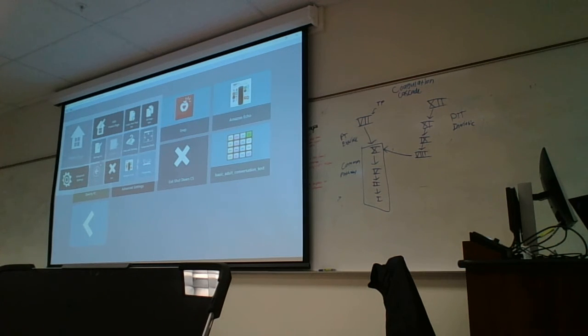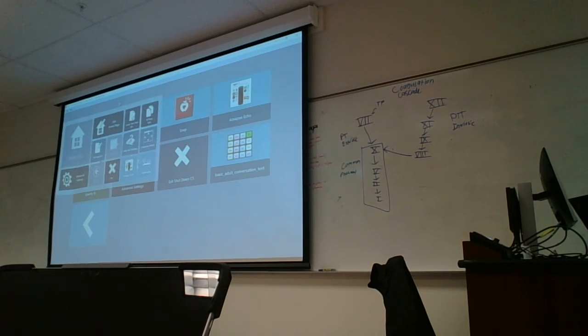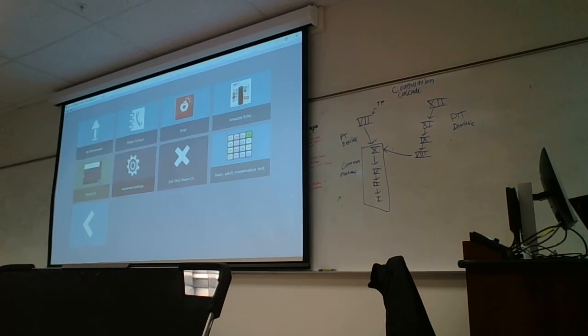Yep. So SnapCore first. A lot of times, even though we're expanding on the aphasia page set for text-based users, if we have some emerging communication users, they would go with SnapCore first. There are some symbol-based communication page sets. If you're starting with someone that has difficulty with access or is just learning, you start with a grid size that's like a 2x2 and then grow it from there.